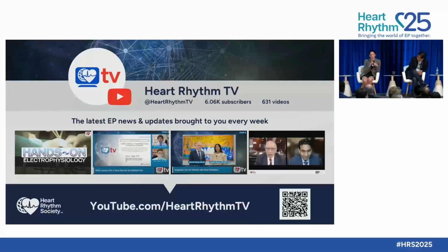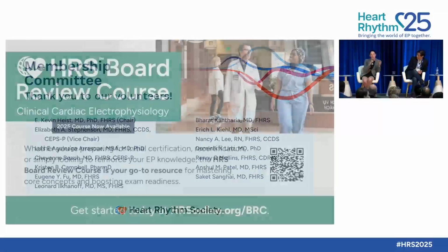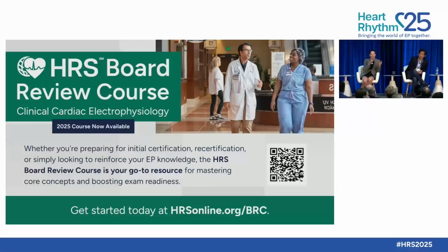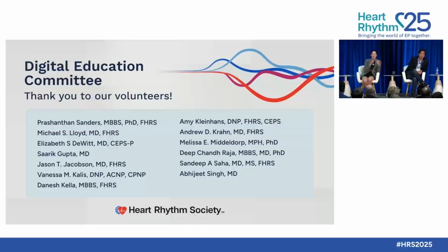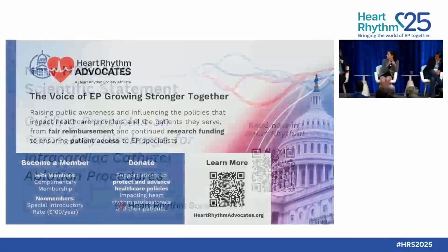And I think the benefit of the AI is you can take it beyond an expert labeler of dispersion. You can say, okay, now I'm going to teach the model the sites, the dispersion signals, where whenever I burn them, AFib terminated. So you can make the model smarter for acute termination, for long-term success, etc. If every one of us were perfect at identifying that, it's great. But when you scale mapping technologies like this, you need an objective method to guide us in targeting the same sites. Yeah, I think it certainly made the trial much more even.